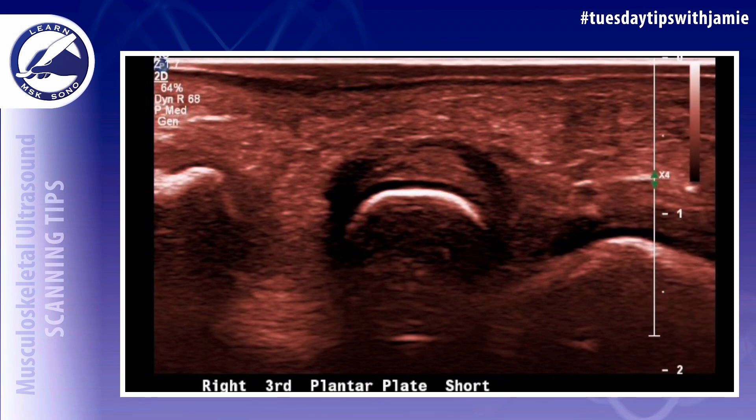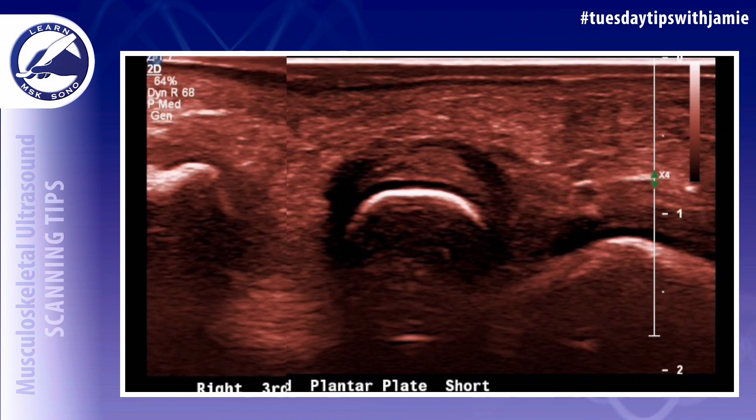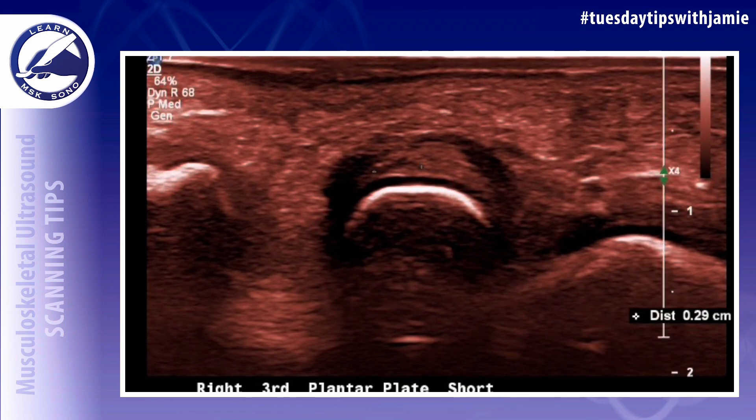And number seven, image the second through fourth plantar plates in the short axis from proximal to distal. Toggle the probe upwards to make the plantar plate as echogenic as possible to eliminate the anisotropy.